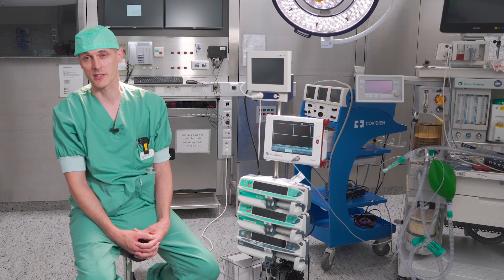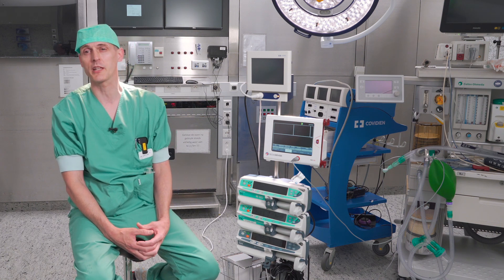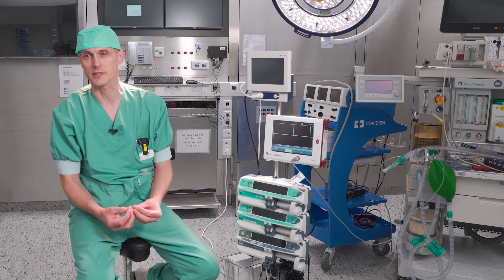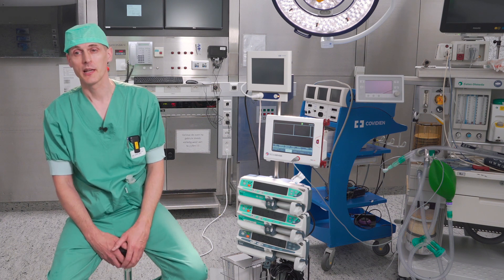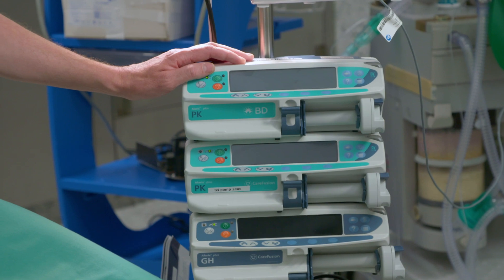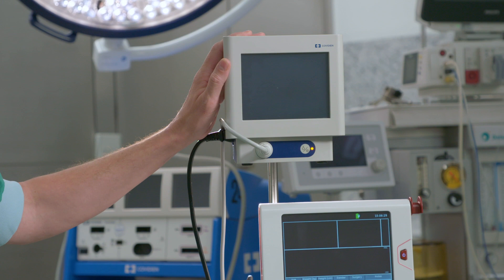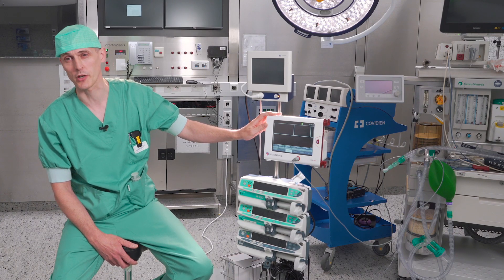I am very interested in anesthetic pharmacology and my goal is to titrate my anesthetic drugs according to the individual needs. Today I will demonstrate how I use several technologies to reach that goal. The technology I need is an infusion pump that allows me to titrate my drugs in a target-controlled infusion way, a monitor of the hypnotic drug effect, and a monitor of the analgesic drug effect.